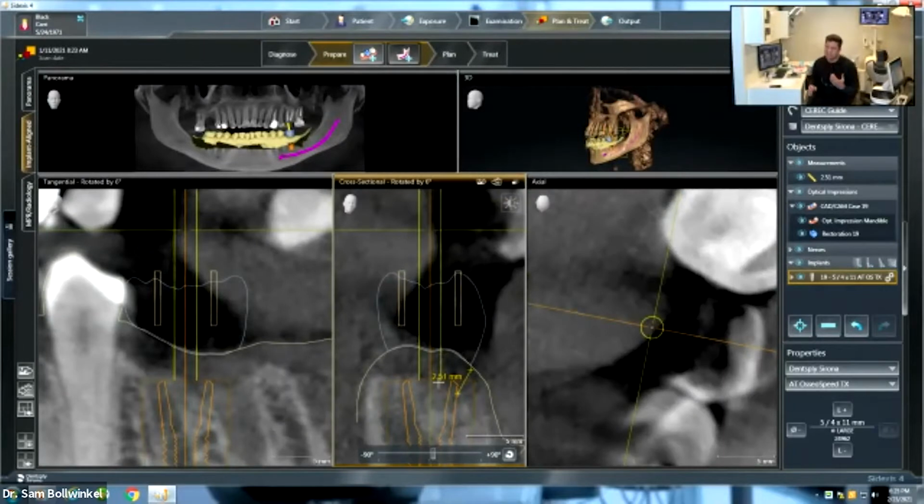So you guys, this is something that we see all the time. I see where an implant comes from a specialist or even another dentist, a patient's moving, comes in and the implant's right at the crestal bone height. Ideal, right? We've flapped it. We've done our osteotomy, our implant's right at crestal bone height. That makes us warm and fuzzy, but we only have 2 millimeters of attached tissue over that ridge.